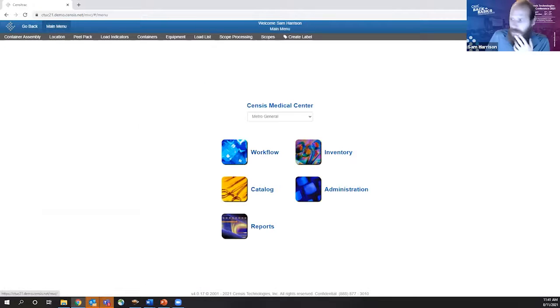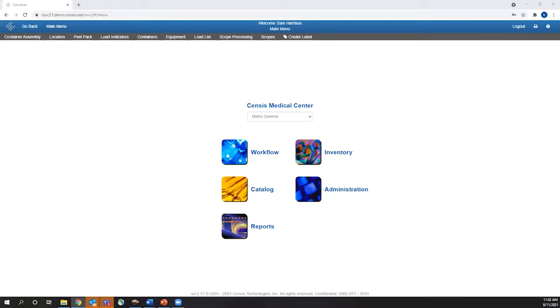Okay. Let me see. So we put the ATP test results in the comments box when the scope is, okay. What is ATP testing? I will let Linda explain that because I feel like she'll have a better description than I will. Oh, Linda answered that one further down the group chat.